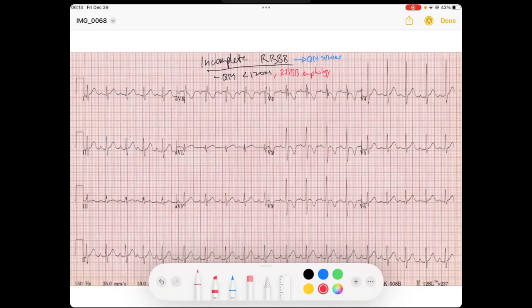So let's take a look at this EKG. We're going to look just at the QRS. As we see, we have a narrow QRS — it's still about 100 milliseconds wide, which is narrow, but it doesn't look right. You look at V1 and you see we've got this RSR prime. This RSR prime in V1.